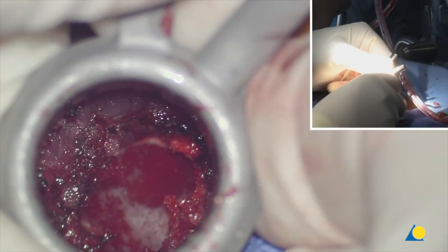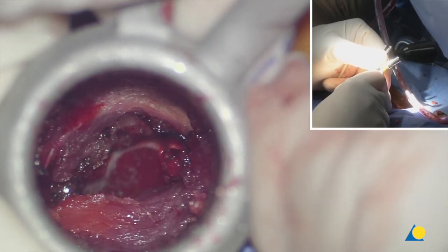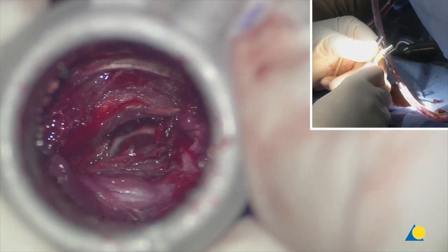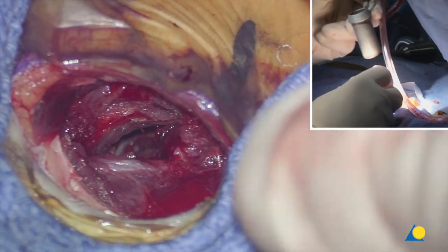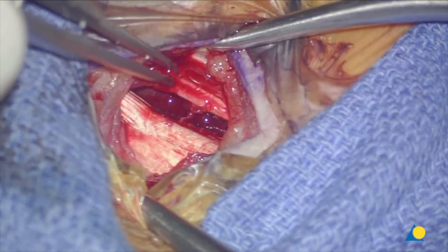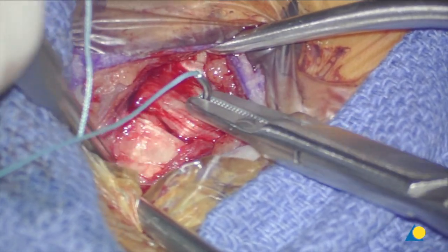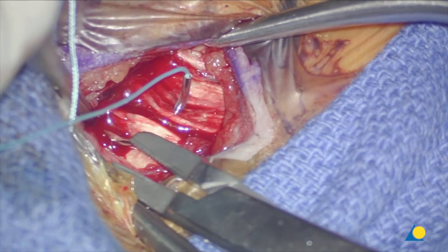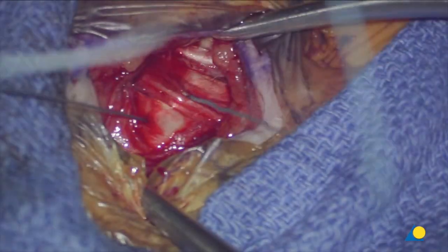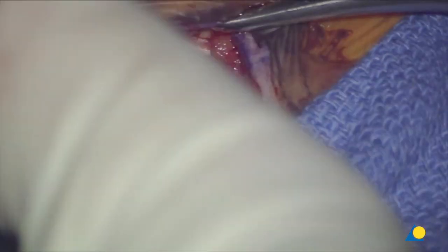Let's take the retractor out. You can see how the muscle comes back together, which is why there's very little pain after this operation. And if you have a CSF leak, there's no real dead space. We'll put a stitch into the fascia and then do the subcuticular closure.